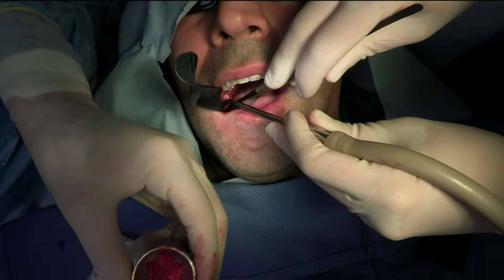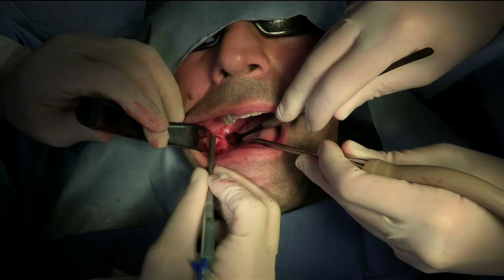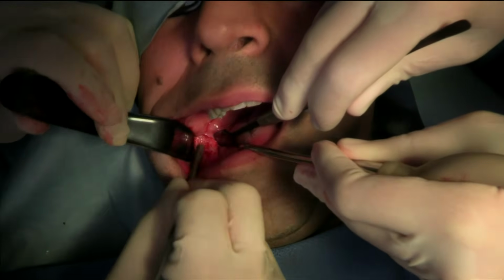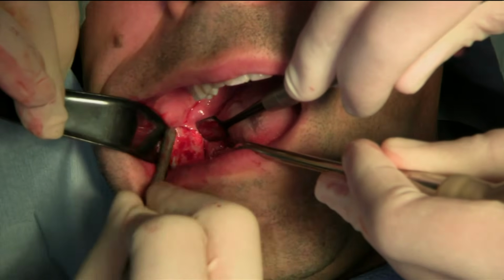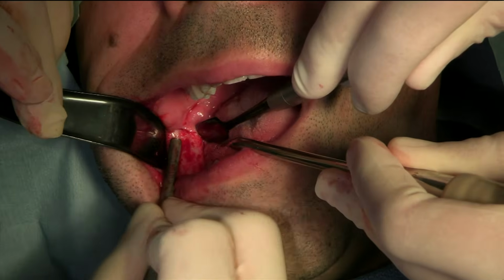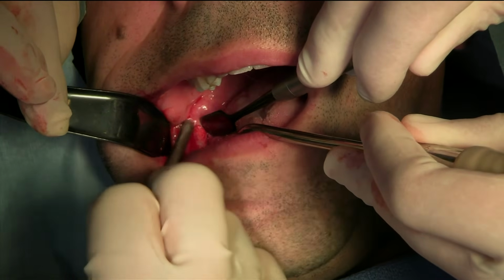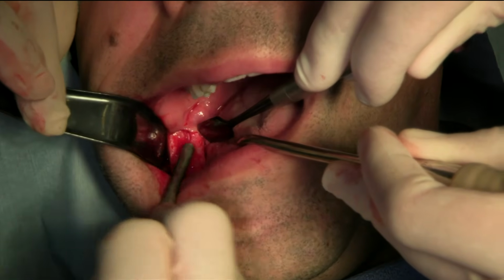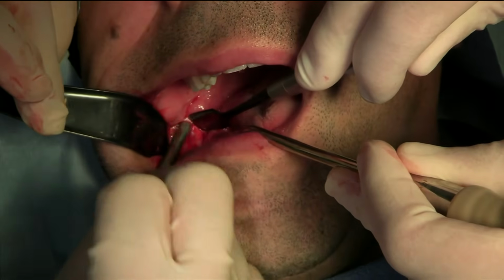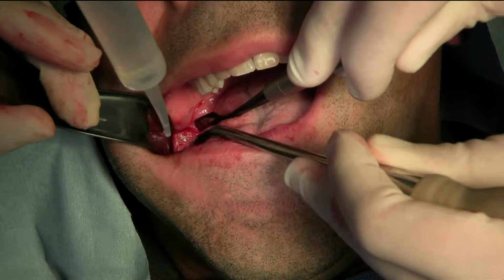Okay, we'll go maybe another 2 times. Some irrigation. Hold this one.